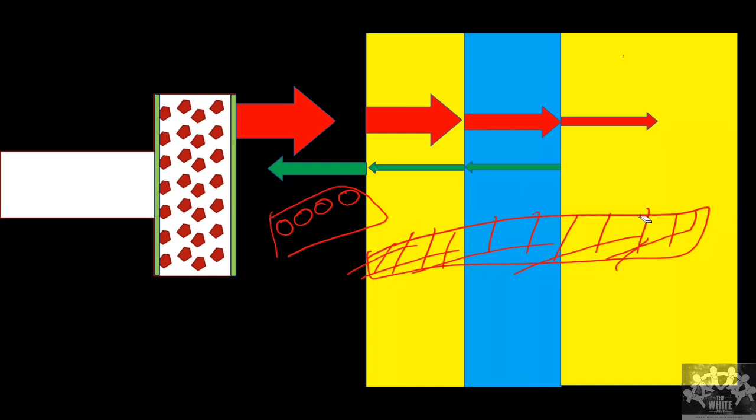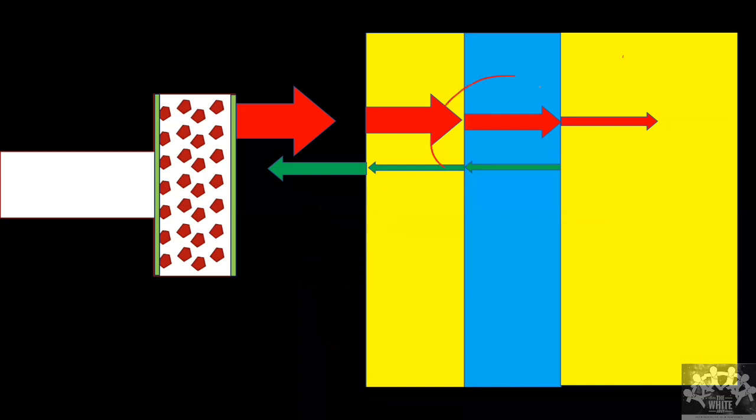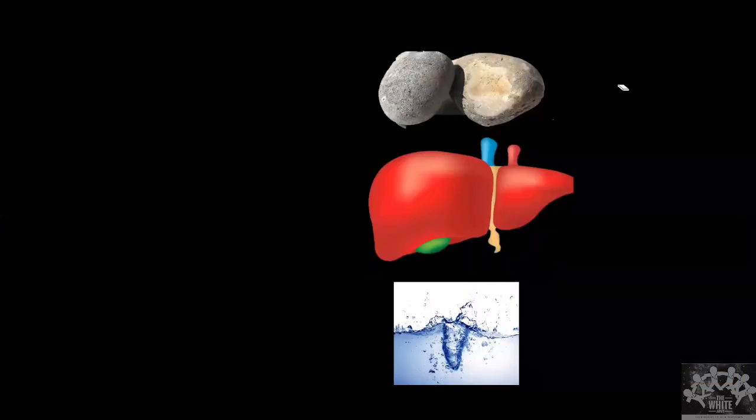So the change in the density, the change in the color of the image that we see, is not because of the depth, even though there is some loss of energy. We correct it by something called TGC. Okay, it is a gain. The gain that we give is increased by TGC, and that will correct whatever the gain is supposed to happen. Now because of that, the entire image will appear of same density if the tissue is made up of the same.